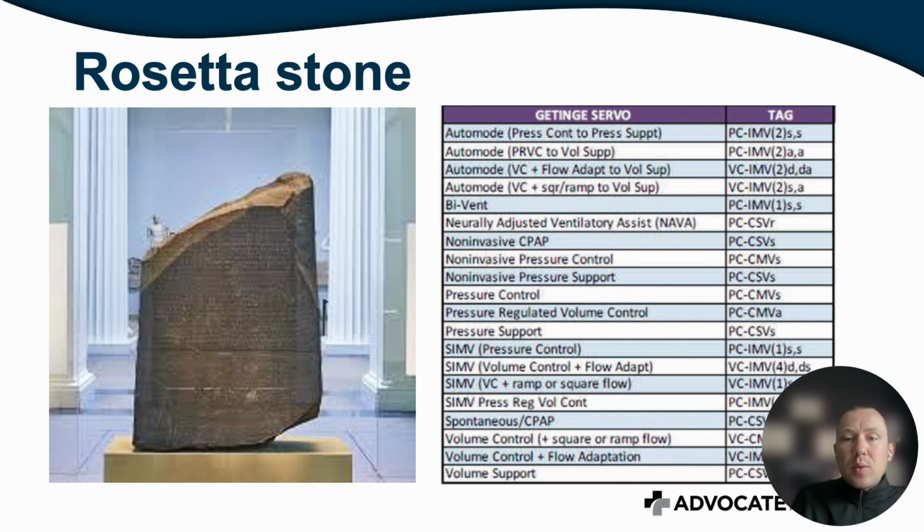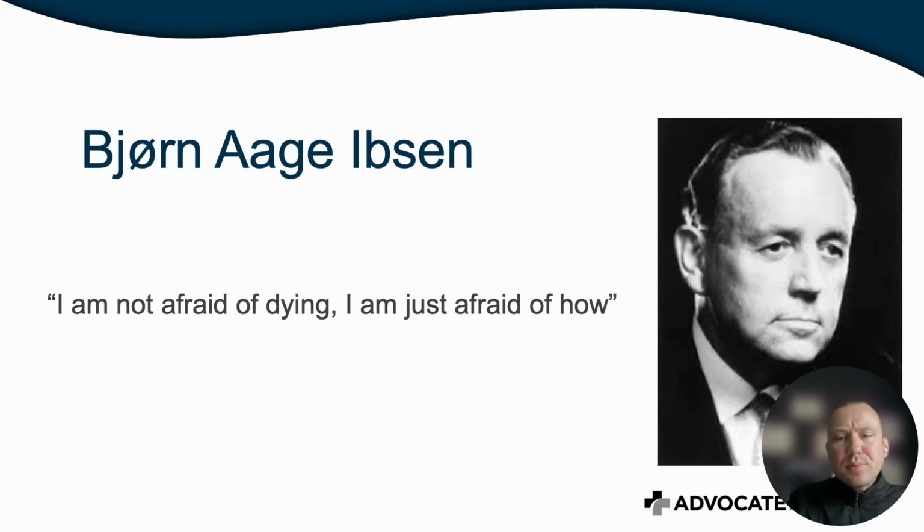This is a Rosetta Stone of mechanical ventilation that I have at my workplace, and I encourage everybody to build theirs. It's for Servo, the ventilators that we use. So here's a list of all the modes that this ventilator has in our existing models. And here's the name of those modes in the common mechanical ventilation language available for everybody, on the laminated cards for whoever touches the vent.